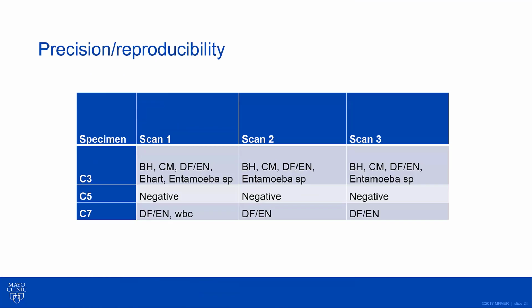We also looked at precision and reproducibility. We had three different specimens and we ran them on multiple days, and also multiple runs on a single day, and positive and negative results did not change. We actually ran 10 specimens in this manner for both intra-assay and inter-assay precision, and they all maintained the same result. So excellent precision.